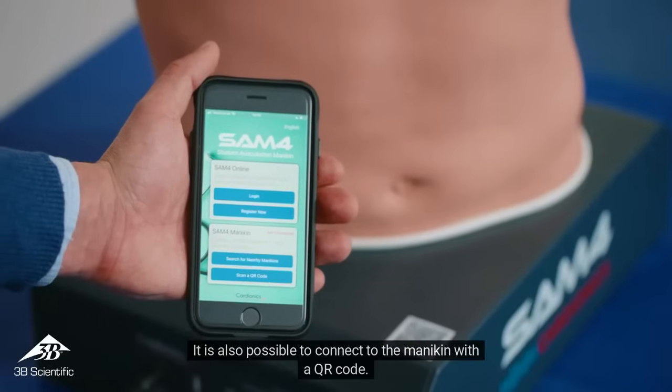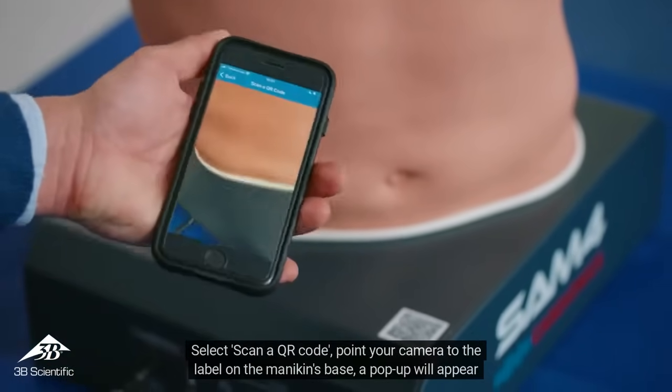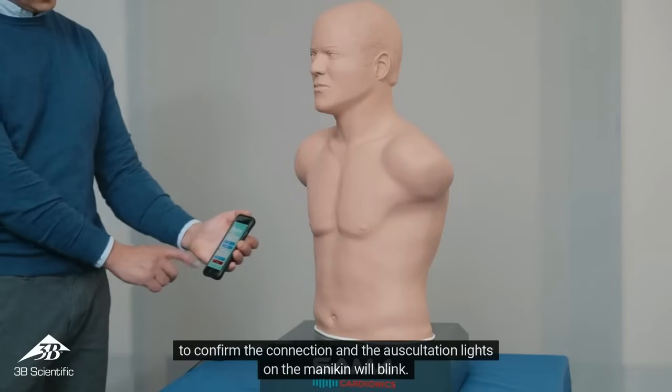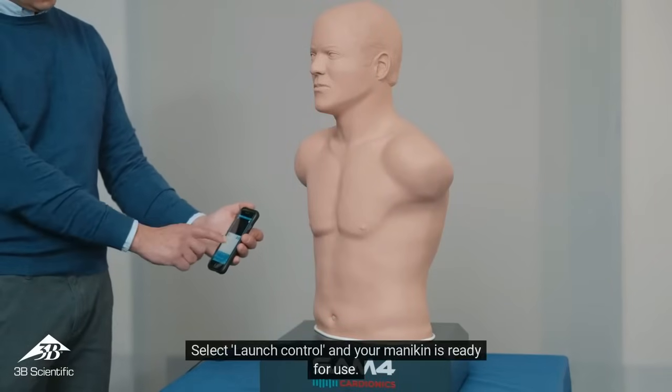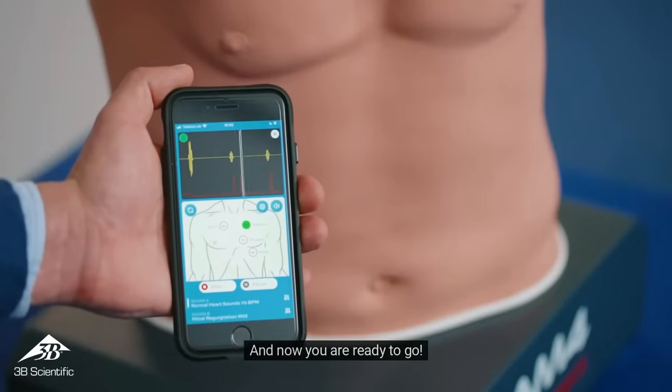It is also possible to connect to the mannequin with a QR code. Select 'Scan a QR code,' point your camera to the label on the mannequin's base, and a pop-up will appear to confirm the connection — the auscultation lights on the mannequin will blink. Select 'Launch Control' and your mannequin is ready for use.